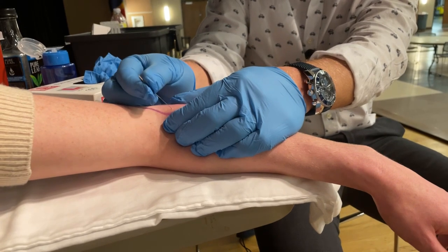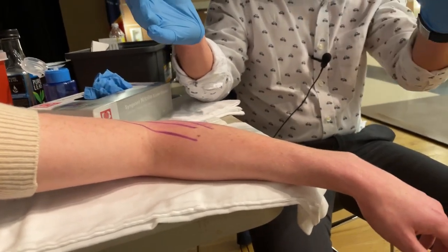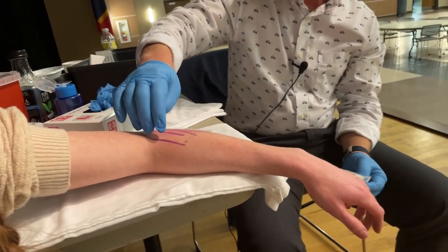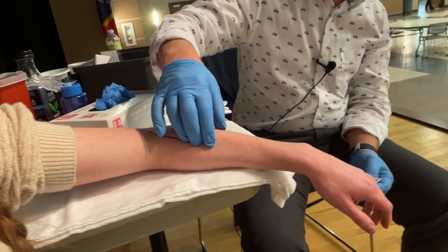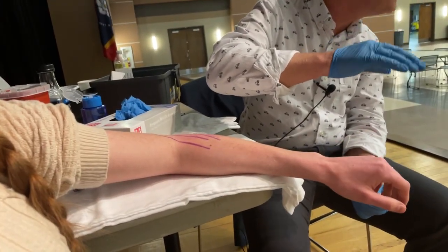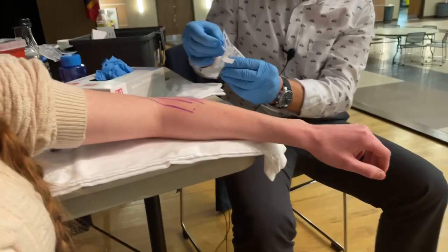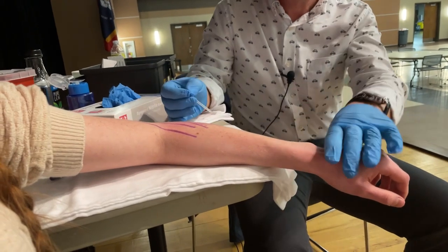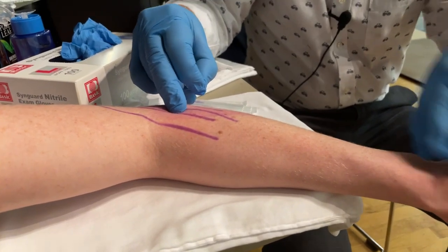You felt a little twitch? Yeah. Sometimes the twitches are rather large and the patient almost jumps, or you'll feel a rather large twitch in your hand, and sometimes they're rather small. I would spend maybe three or four needles on the brachioradialis working the length of the muscle. Usually the larger portion of the muscle is where the trigger points reside, and that's the area where you'd spend your time needling. Raise your wrist up — hold that, Katie — and relax. There's the ECRB tendon.